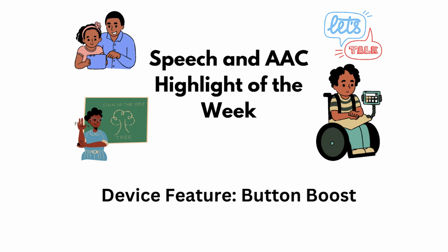This feature pretty much allows you to enlarge a specific word on the device. So if you have a word that you want to focus on, a core word of the day, this is a great feature to bring attention to that specific word.